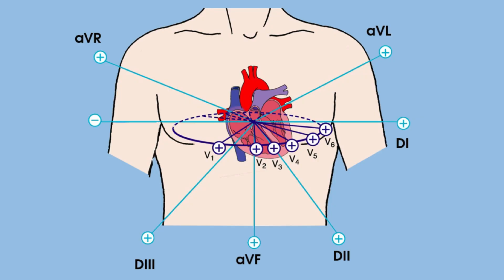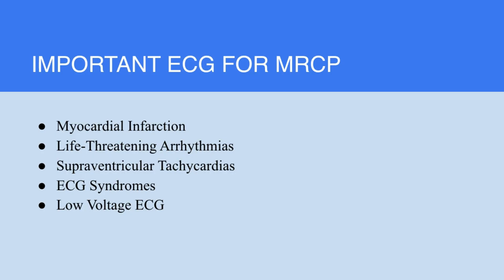These are our famous leads: the AVR, the AVL, the AVF and lead 1, 2, 3, and then the chest leads from V1 to V6.